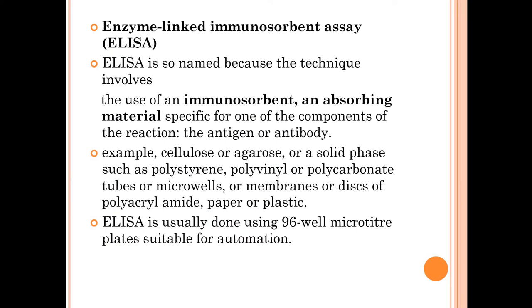So why is it called enzyme-linked immunosorbent assay? You know the enzymes are highly specific towards their substrate. In this test, there is use of the typical reaction between enzyme and its substrate. That is why enzyme. And it is linked immunosorbent.